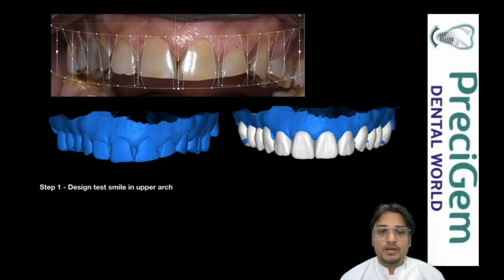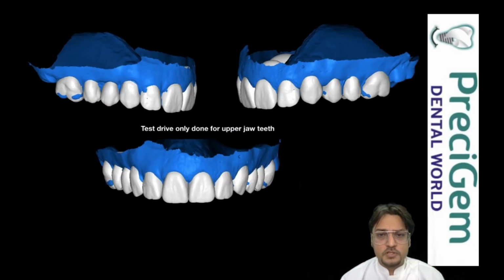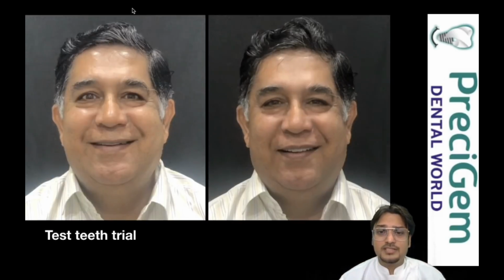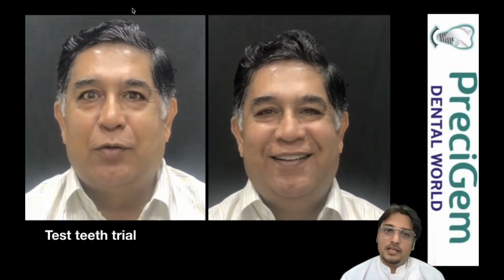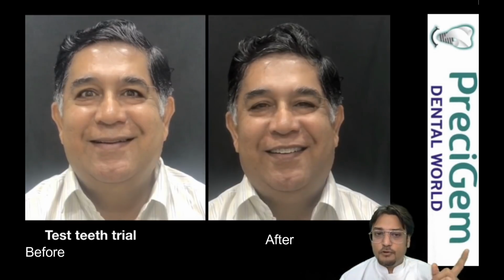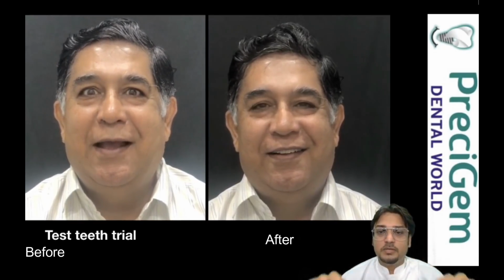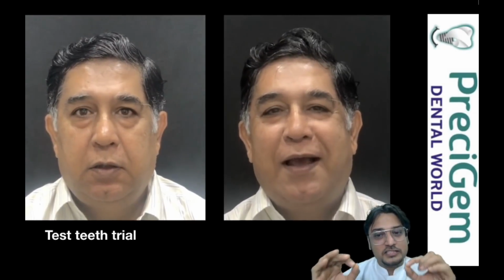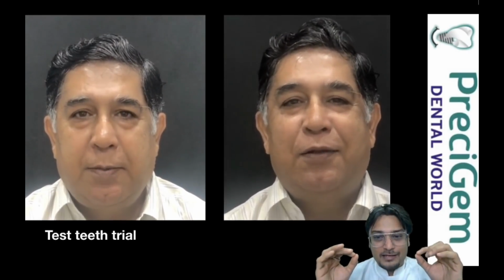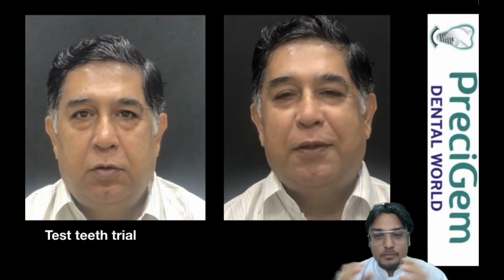Now this is step 1 where we do a design smile approach. Here the test drive is done in the upper jaw, and here you can see the difference. This is just the trial, my friends. This is not the final result, this is just the trial. You can see in the before options there is no teeth visibility, but after giving just a test trial to the patient, the teeth are visible and he is expressing it in a very beautiful way.